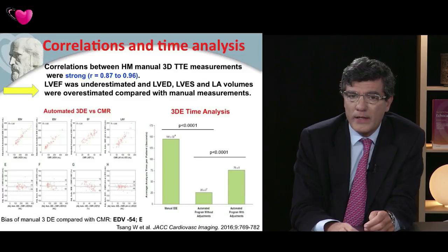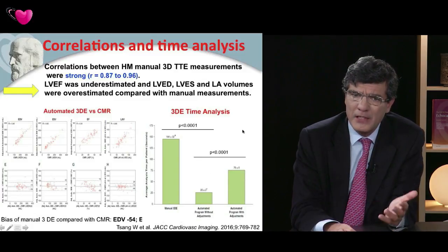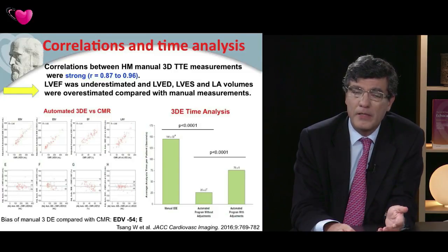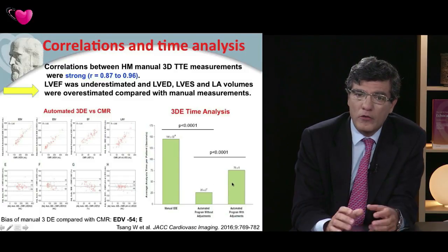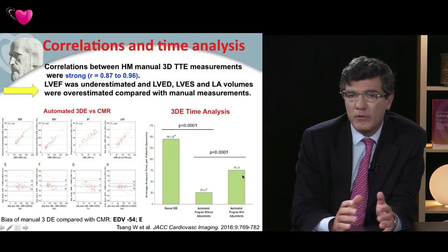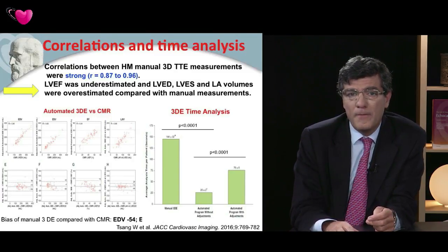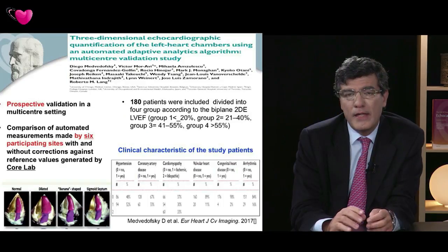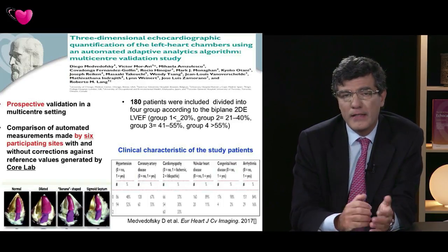Also, it's quite important to know that it really saves time. And this is very important. Efficiency is getting very, very important in our labs, in our hospitals. So even if you correct or adapt the model and slightly modify what the system gives to you, you save time. Well, do we have a multi-center study in order to validate the heart model?